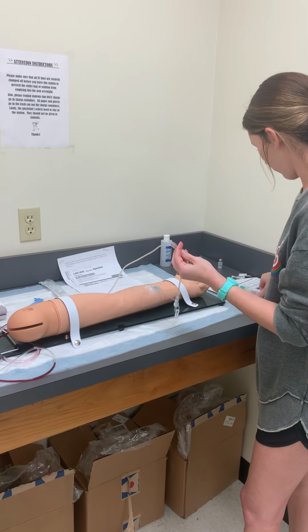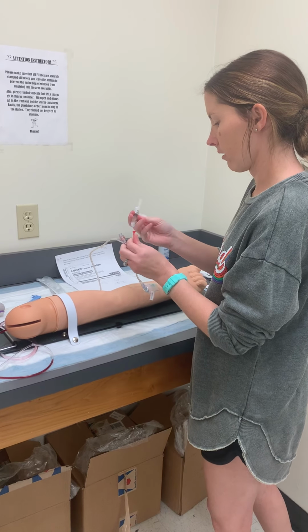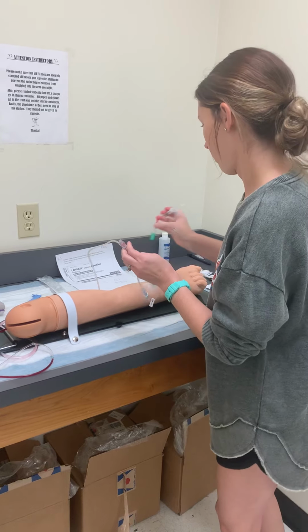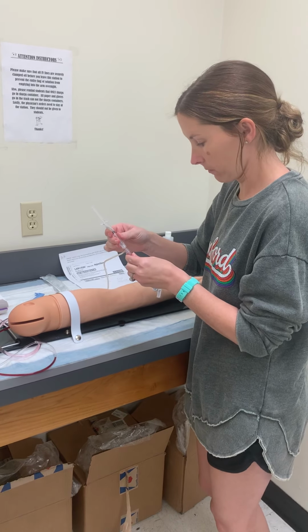Okay. And I want to take off my needle, since this is a needleless push, and attach my syringe.